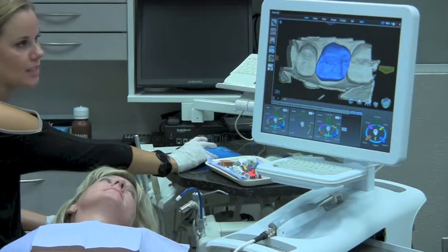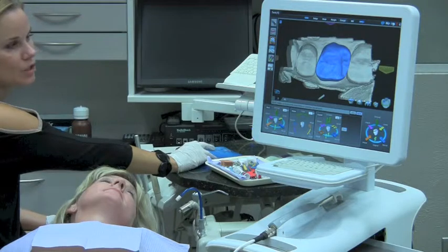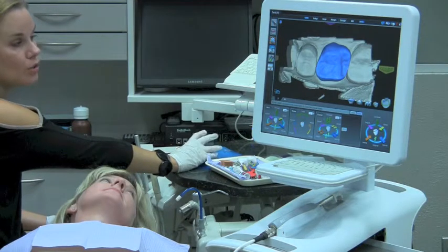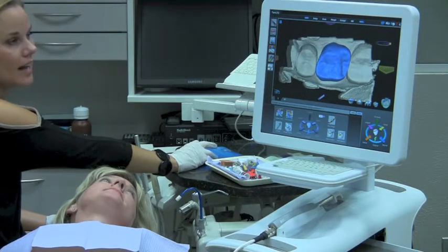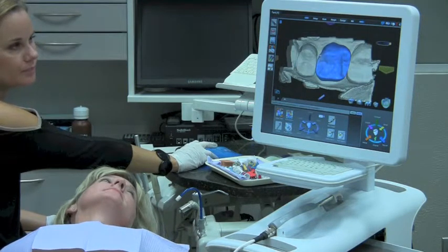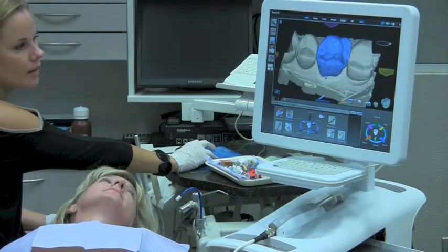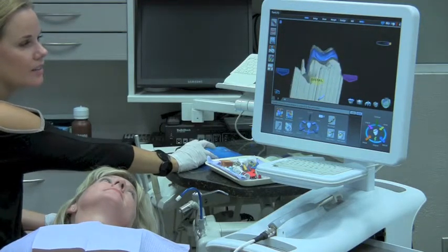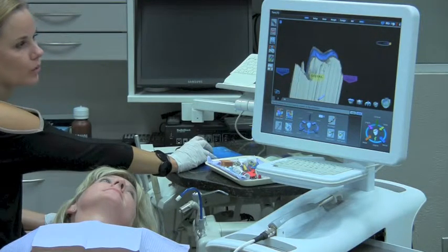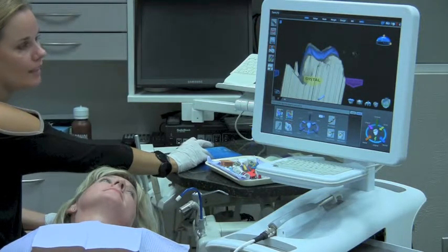I don't see any alignment changes I need to make, except maybe expanding the lingual aspect just a little. So I can go to my freeform toolbox, which is more artistic tools, and I can close embrasure areas, bring a cusp out, or increase some contour. Looking at the tooth in different aspects, I have the ability to lower the marginal ridge height, or round off these cusps a little bit if they're a little too pointy.